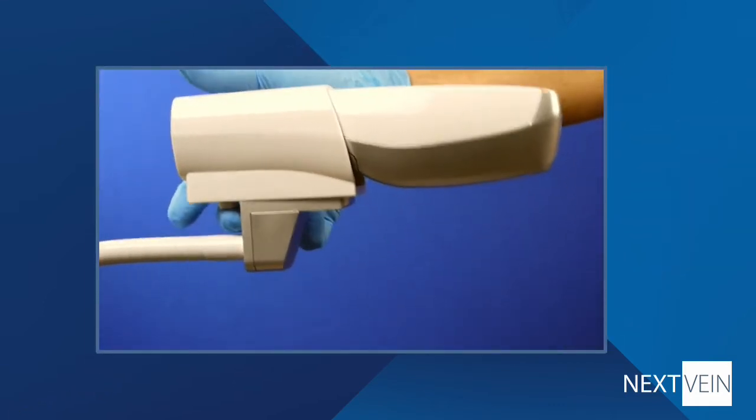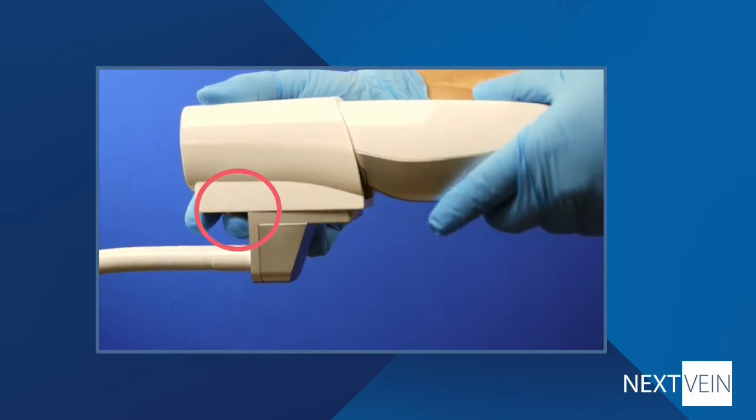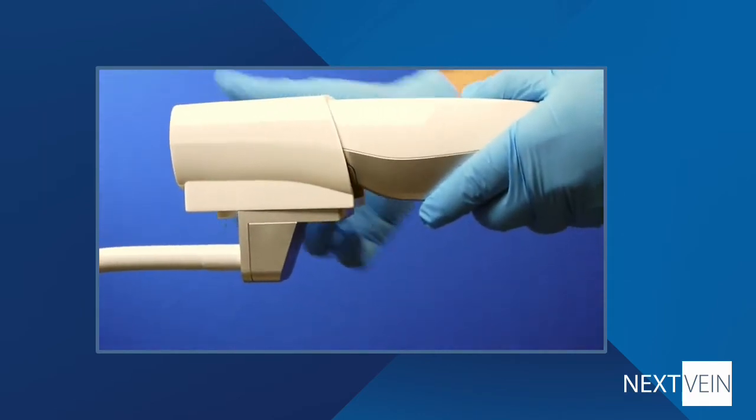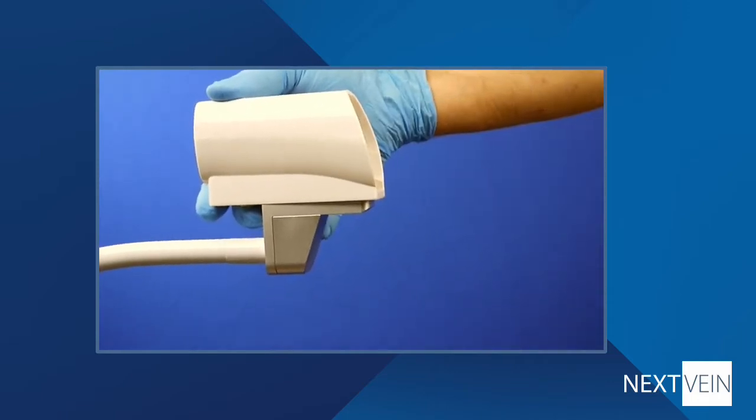To remove the device from the stand, press the button under the rear of the cup. To return the device to the hands-free mode, slide the device into the cup until you hear the latch click.